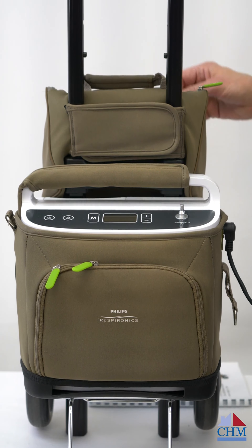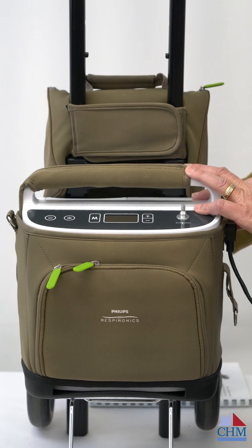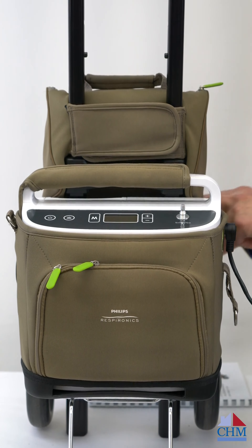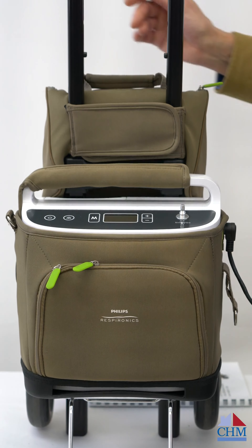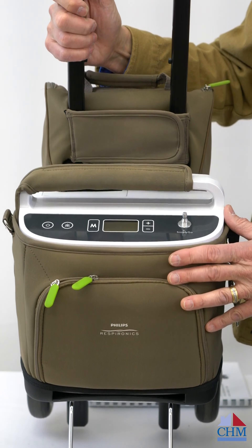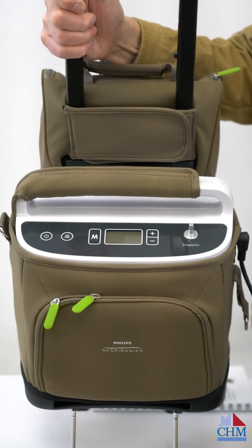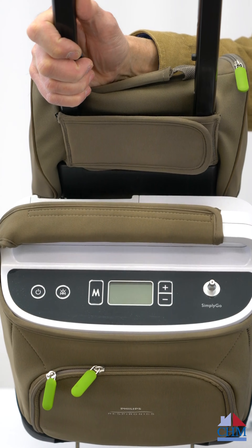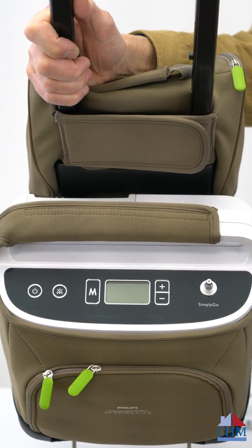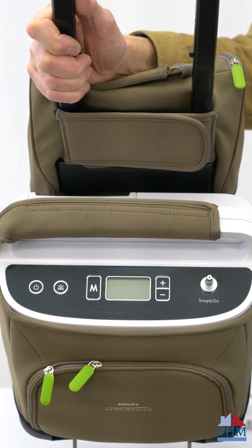The unit does come out of the cart — it's velcroed into position. It comes off easily and has a shoulder strap if you want to carry it that way. It weighs about 10 pounds. It's not the lightest unit we have, but not too bad at 10 pounds.